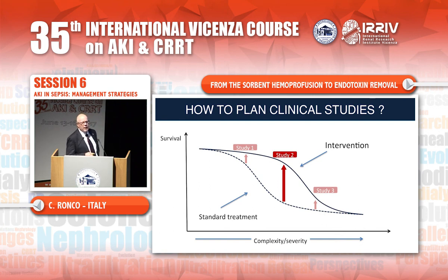However, what we have to work with now is the tails. These patients, are we applying futile therapies, or should we do anything for this patient to avoid this patient to move into a higher severity level? Or in the more severe group, do we have to increase the removal of endotoxin? Maybe do we need to do more sessions, longer sessions, higher capacity for removal? This we don't know, and this will probably be an area of research for the years to come.